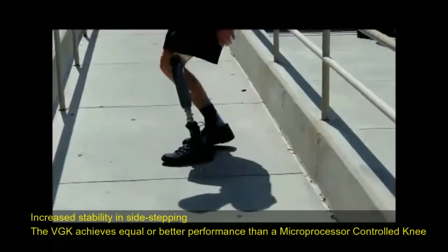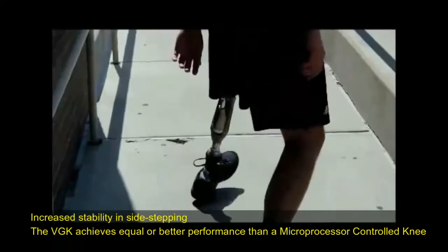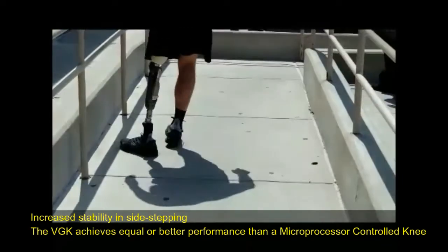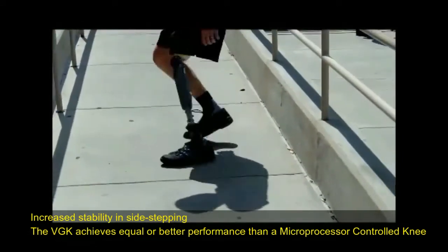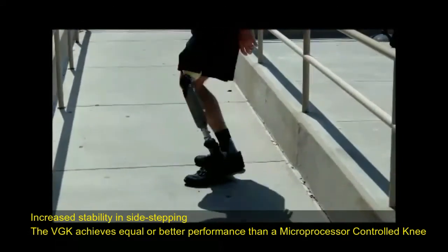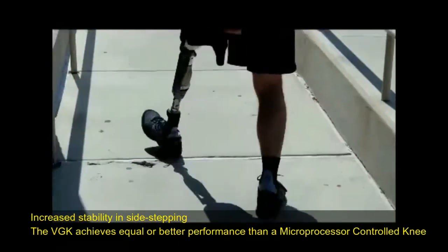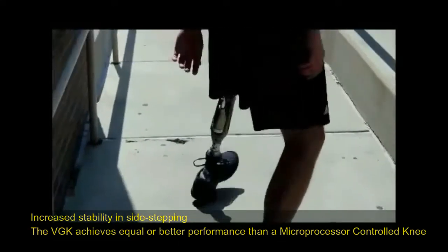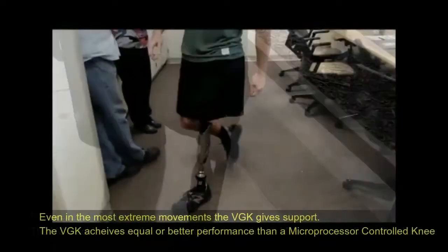But when we have stance and we have swing and we change angles, we have people like this guy. I gave him the job of trying to trick this knee. I want him to fail. So this is a series of things that he's doing to try to get the knee to go out of stance and into swing inadvertently that would make him go down. And he can't do it.